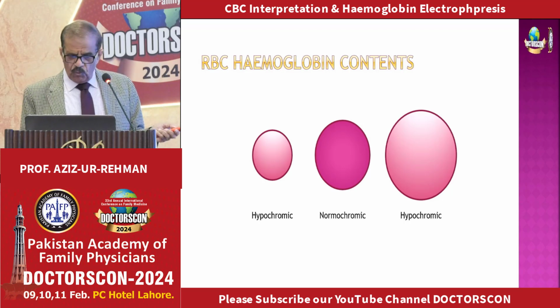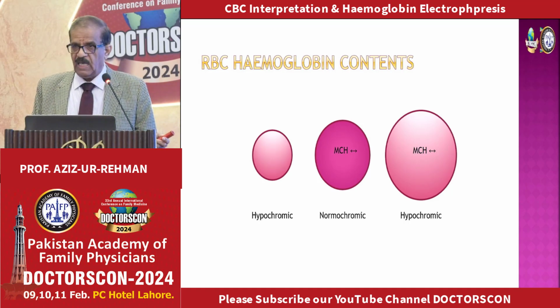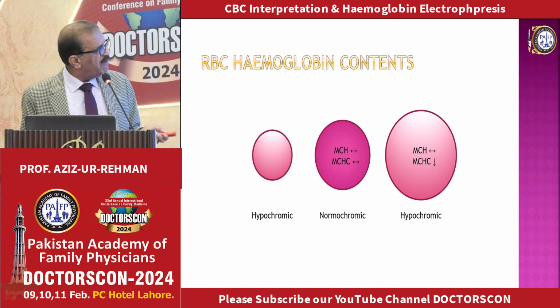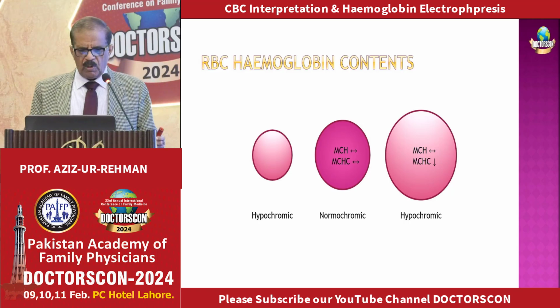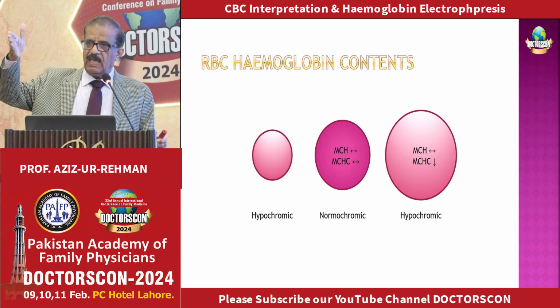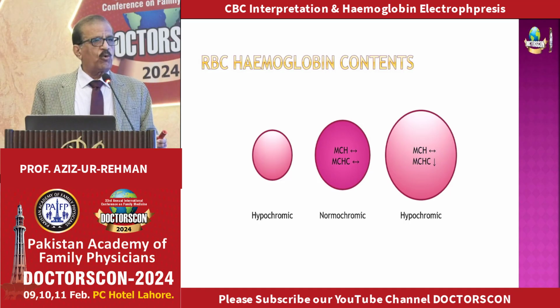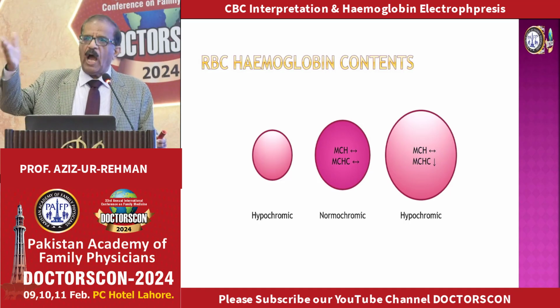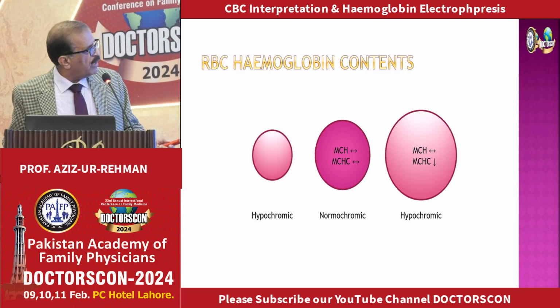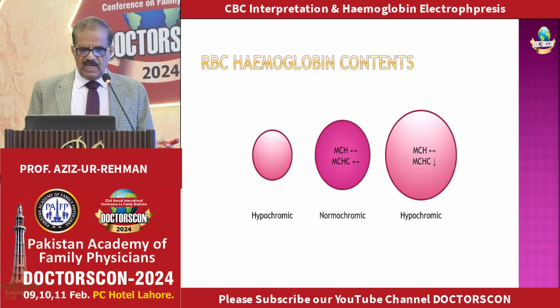So if you measure their mean corpuscular hemoglobin, they might have the same. In fact, this might have more, but it has got less concentration, and that will be reflected by another measure called mean corpuscular hemoglobin concentration. So we refer to the size as macrocytic, microcytic, normocytic. We refer to the amount of hemoglobin as normochromic or hypochromic. Then we refer to the concentration as mean corpuscular hemoglobin concentration. And then another term which is used in CBC is RDW.